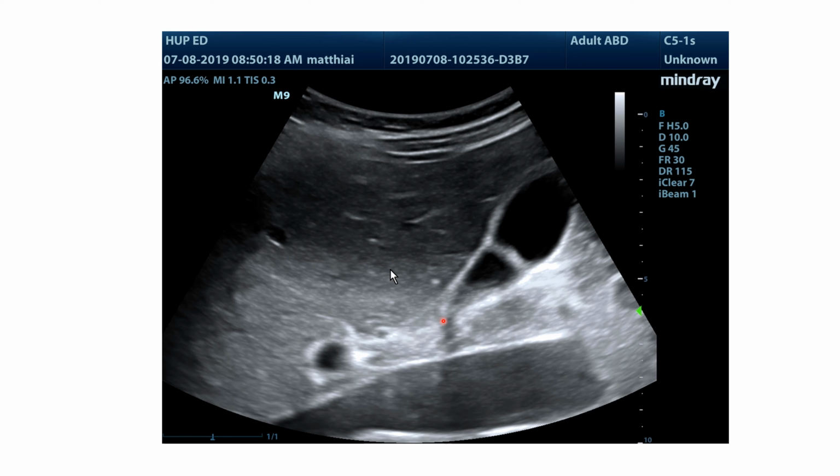This band of hyperechoic tissue at the far field of the image. I guess this is not completely disabling, but if there's a big stone here in the neck of the gallbladder, you may miss it because your TGCs, your gain in the far field, has been turned up or forgotten to be adjusted and left too high, making this artifact band across the far field.